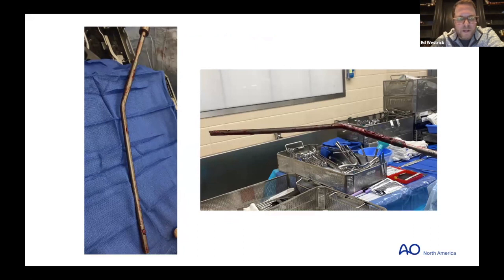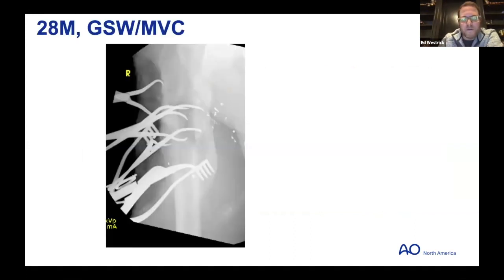I initially left a distal crosslock screw in, and my lovely team of residents and fellows let me wail on this thing for a good while before I made a first-year med student mistake and realized we still had a crosslock screw in it. So once that came out, the nail came out easy. And here's our reduction. There was geometry to this fracture, but really a segmental injury. We were just realigning it. This is where he was before the crash.